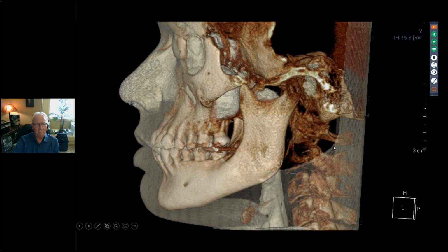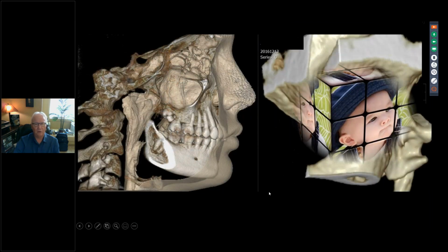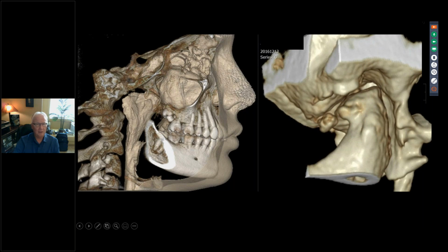We can do funny and wonderful things with the data. You can assign color, transparency, and opacity to the little cubes called voxels in your volume and make these stunning images. The principles are the same no matter what size volume. You can assign color, transparency, and opacity.